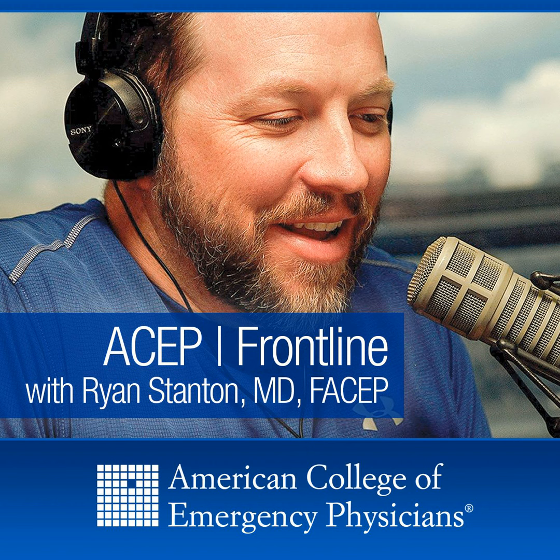It is interesting that what this allows us to do is better evaluate the status of what we're accomplishing. So PEA is not necessarily PEA. Right. It gives us a better actual visualization of what the heart is doing at that time. And interesting, you talked about chest compression location, because I know that's one of the discussions about mechanical chest compressions, the issue with the fact that we're not seeing improved survival, the fact we're pushing on the aorta, on the root of the aorta, not on the actual ventricles.